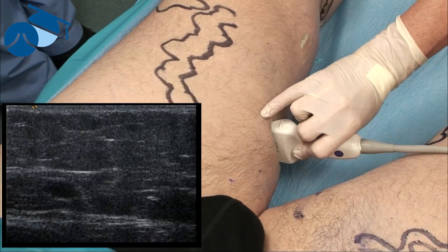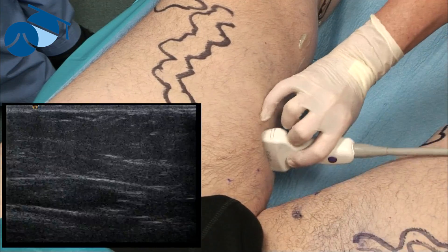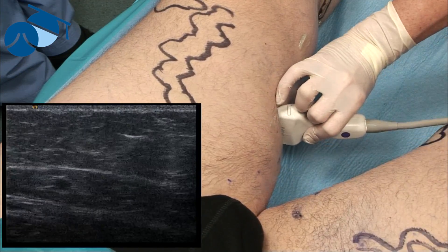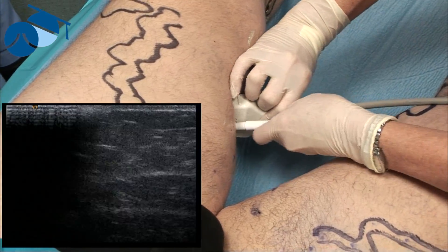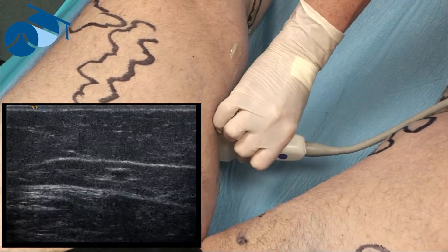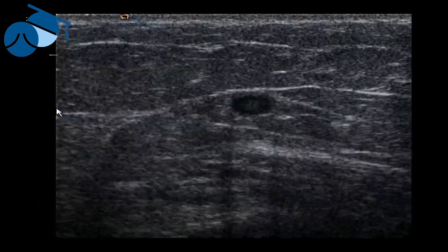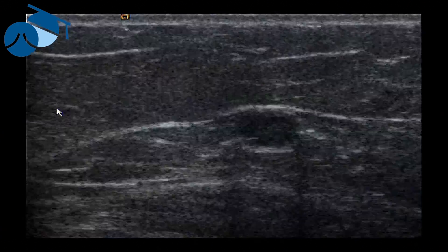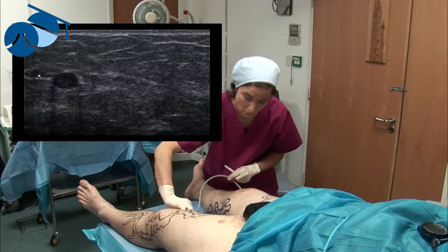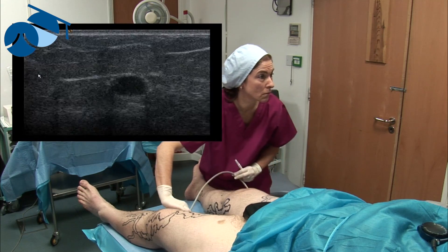As we come down we make little marks all the way down. If we were using the ClosureFAST system we would need to make these six and a half to seven centimeters apart, so we'd know exactly how much each section would require to be treated. However, using a continuous technique such as endovenous laser or the RFITT device for radio frequency, those are not specific for each treatment section, so as long as we have regular intervals to put the tumescence in, we're quite happy.